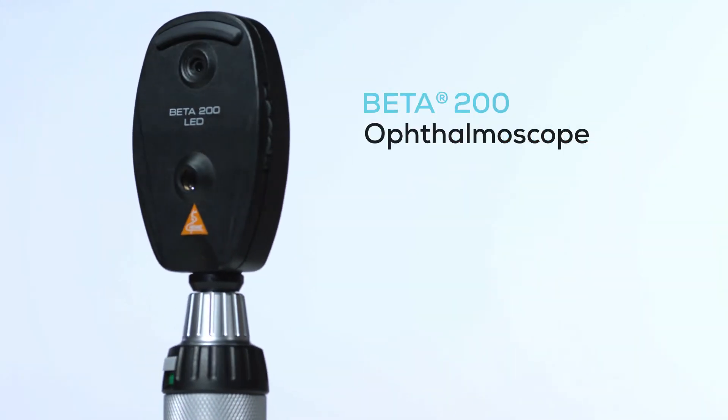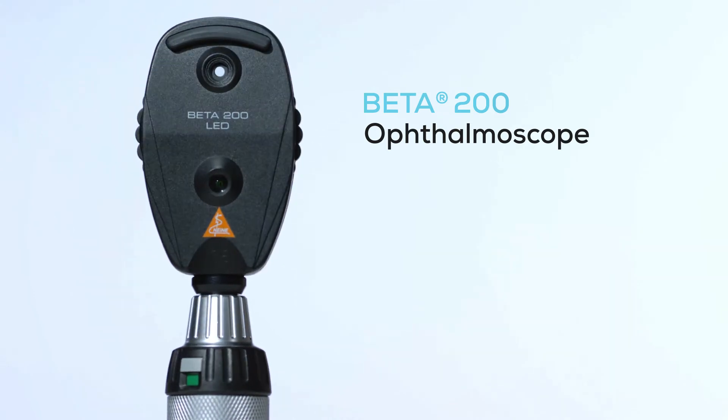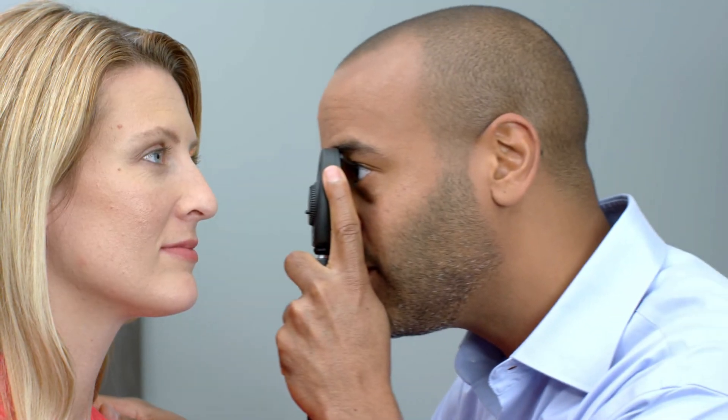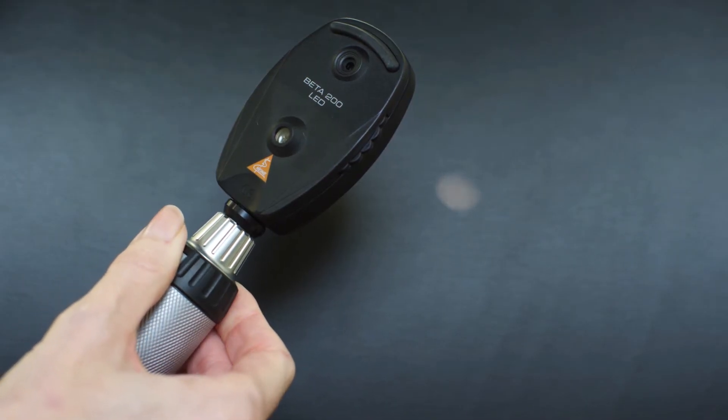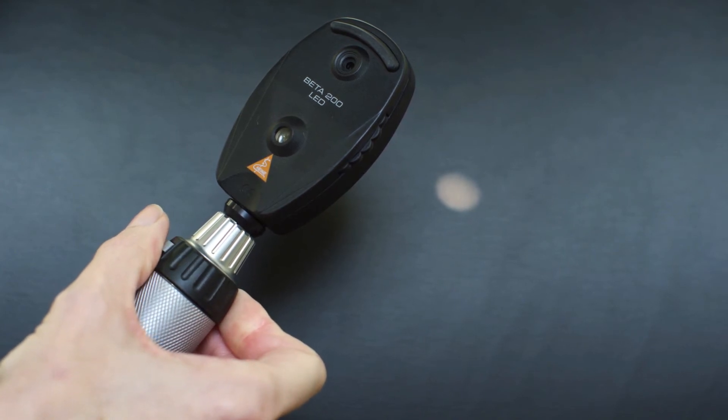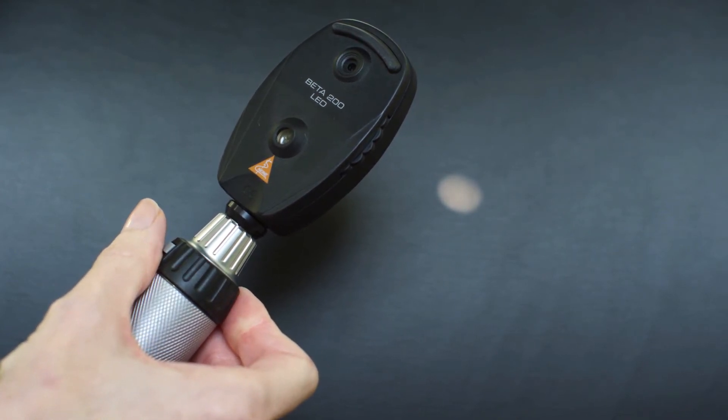The Beta 200 ophthalmoscope includes several exclusive technologies. With any new technology, it's important to familiarize yourself with the controls and operation procedures to ensure you get the best performance possible. There are a few basic controls on the Beta 200. First, the on/off button, which controls the power and brightness of the device utilizing a rheostat.